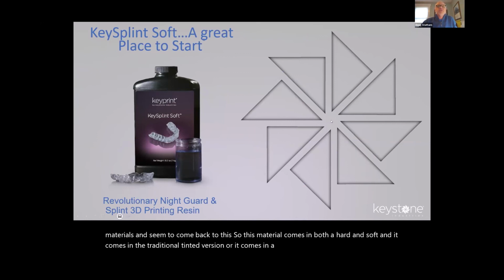So the clear version is going to be available on many more printers by the end of the year. We're in the process of validating most of those as we speak. It was an exclusive product to the Carbon, and now it'll be available on just about every printer that's out there.